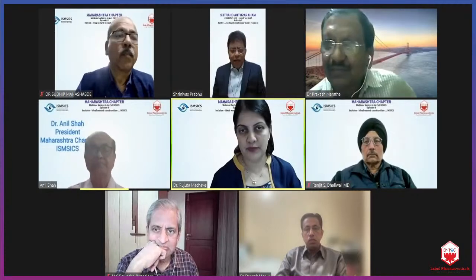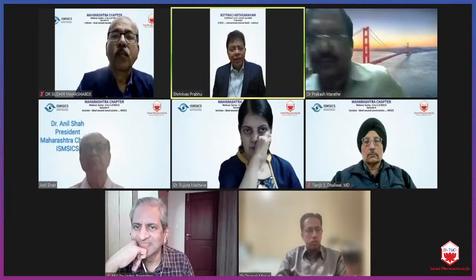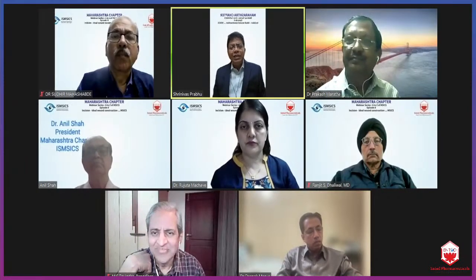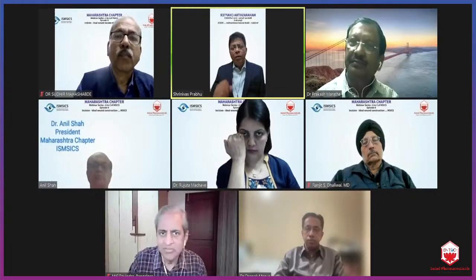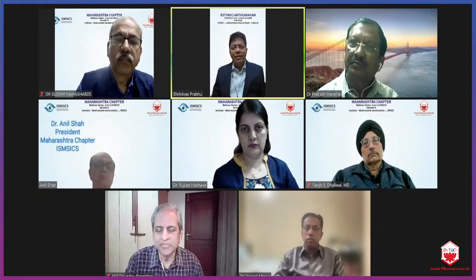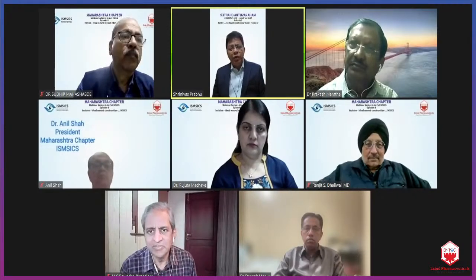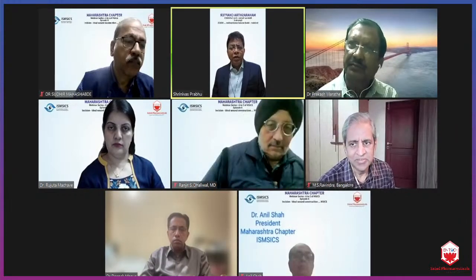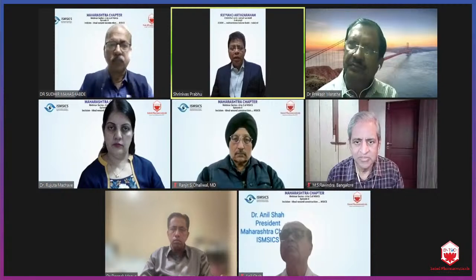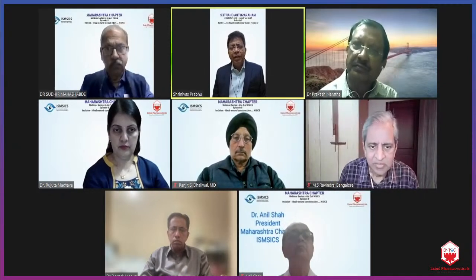Yes, Dr. Prabhu. I am exclusively doing only SICS for 25 years. So I have been using this 300 micron blade for all my cases. And since then, we get a fantastic plane for beginners. It is really good, or even for others. As the previous doctor, Dr. Thangaraj, said, we just cannot go in some different plane. We get a really fantastic plane.